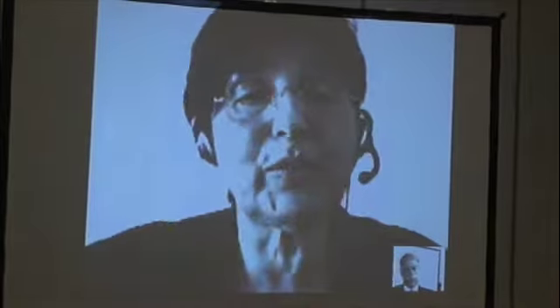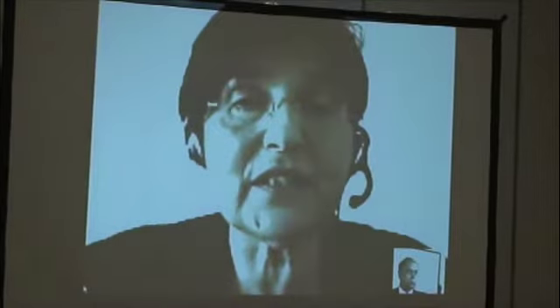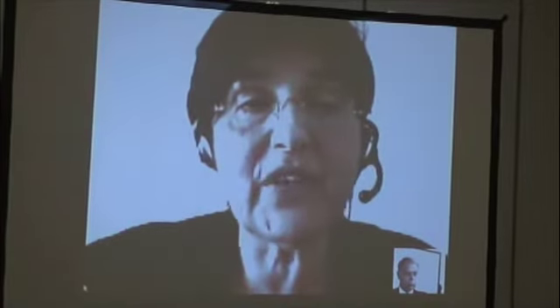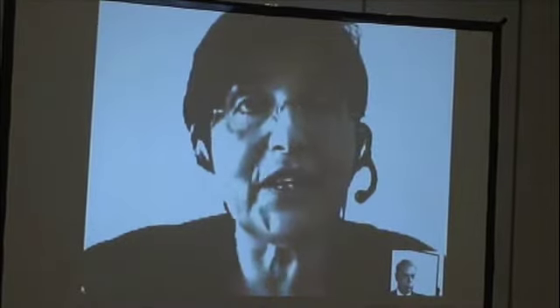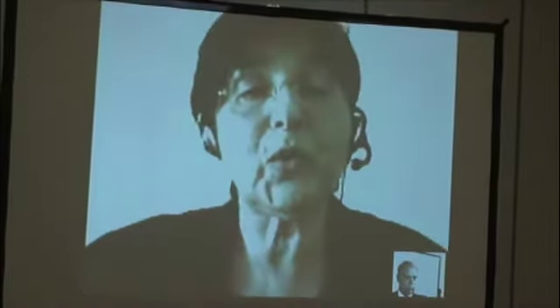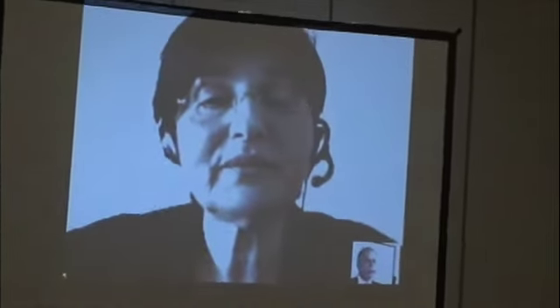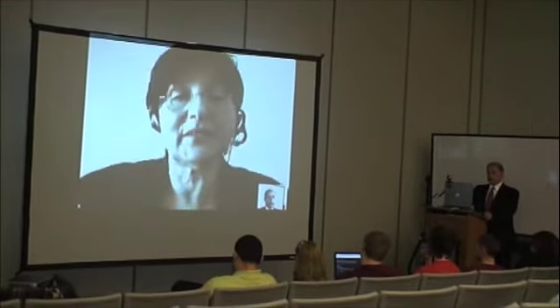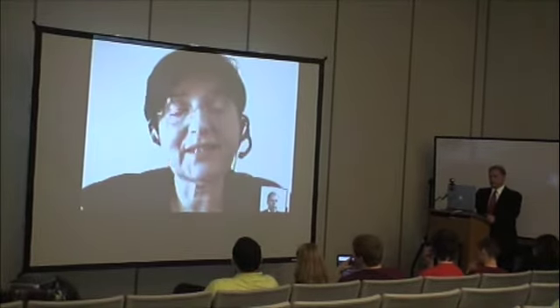So we are able to see the blood oxygenation in the cortex, which means if the brain needs to function, if it's activated by paying attention or trying to form memory, it will bring red blood, oxygenated blood. And we will see that signal. And when activation utilizes this oxygen, the blood will become blue. We will see that too. This is what we call oxygenated blood, deoxygenated blood. Okay, so you are looking at the absorption and scattering that is due to oxygen in the blood, in the brain.